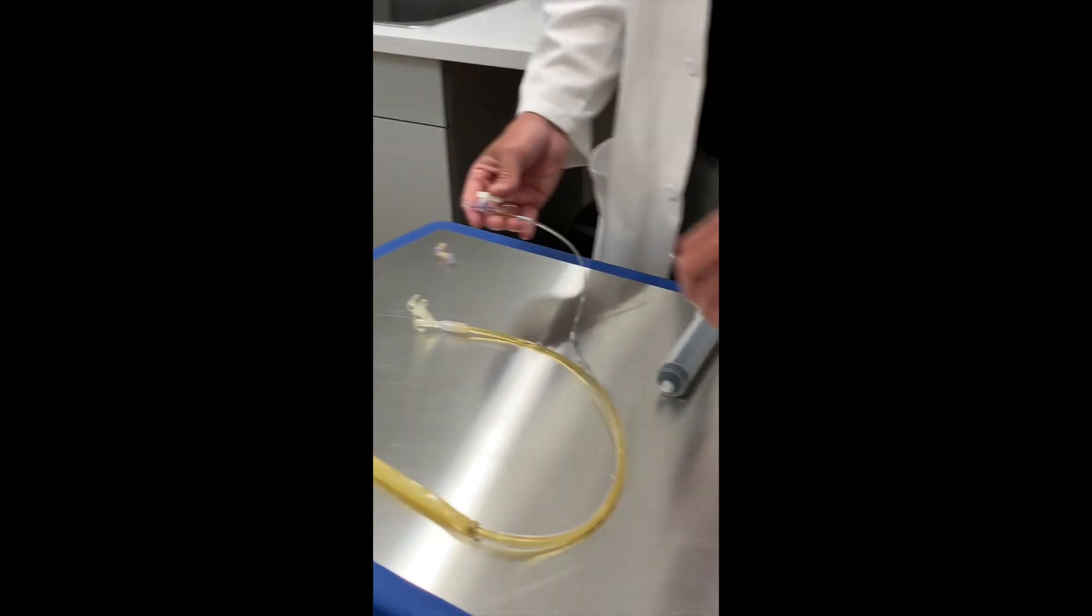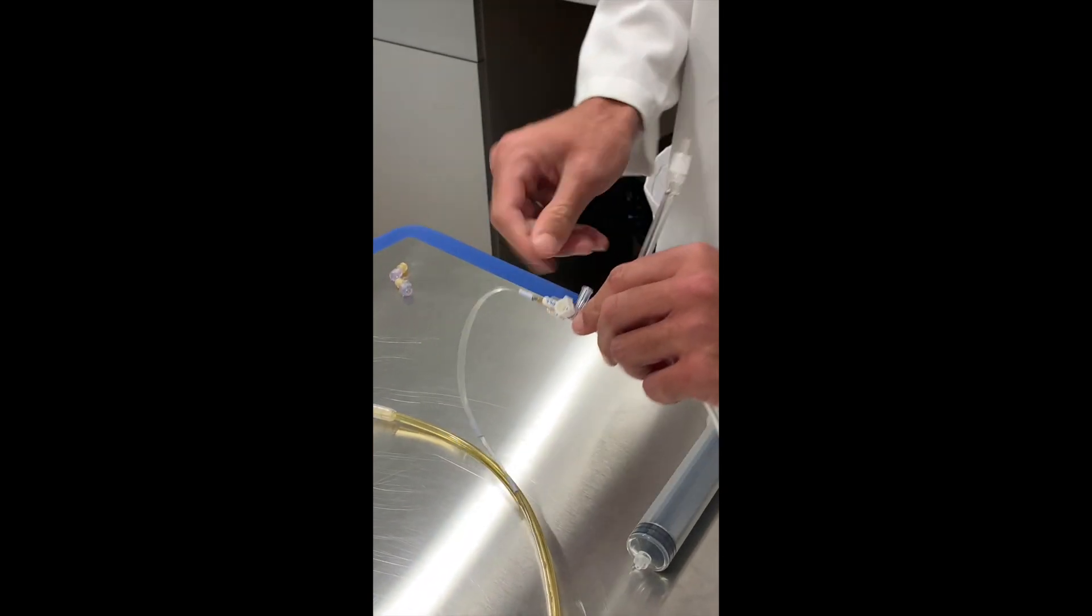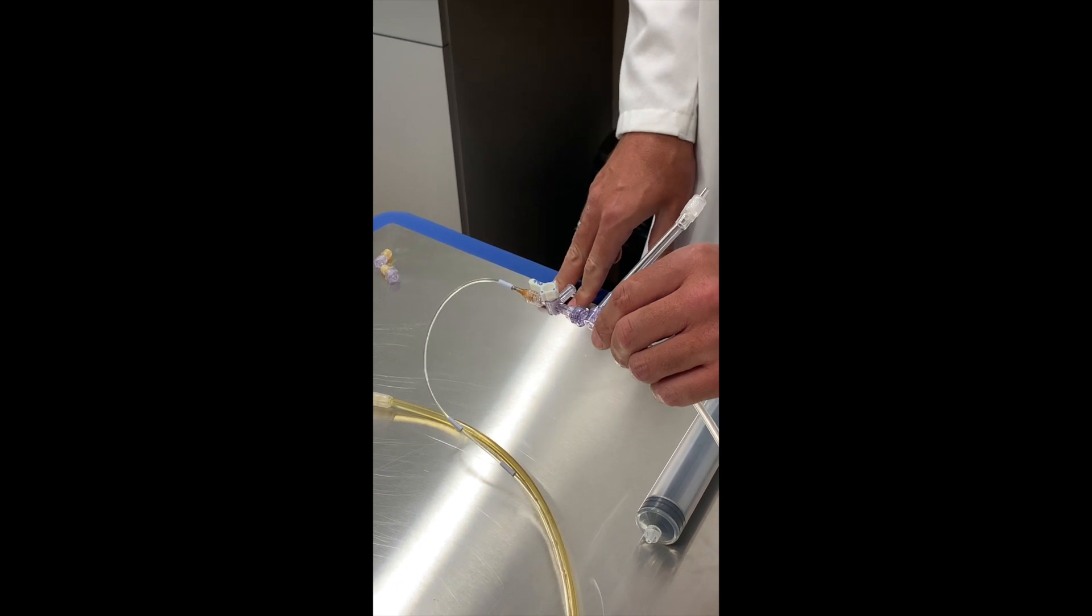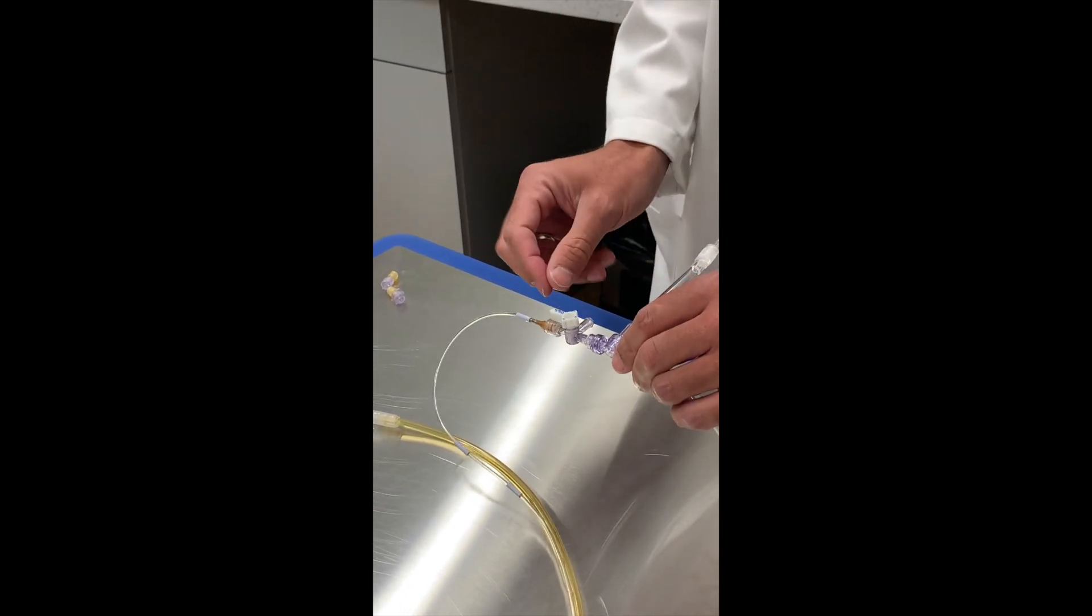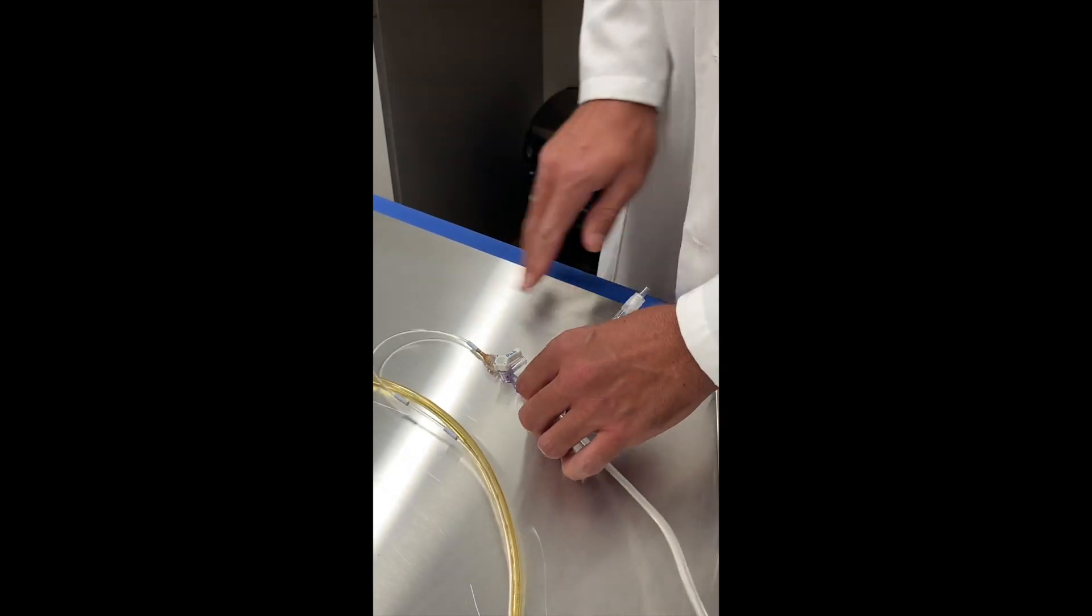The next thing we do is hook up the inflation device opposite the patient. Then we turn off to atmosphere because we're now ready to do the inflations.